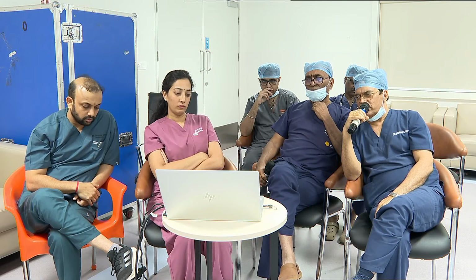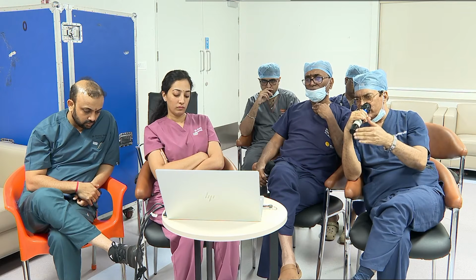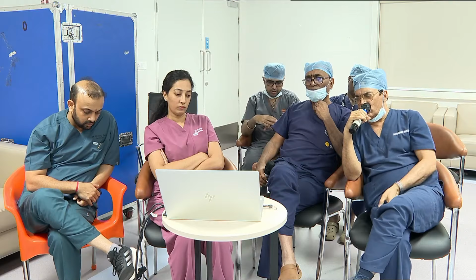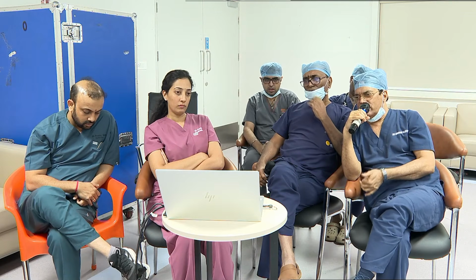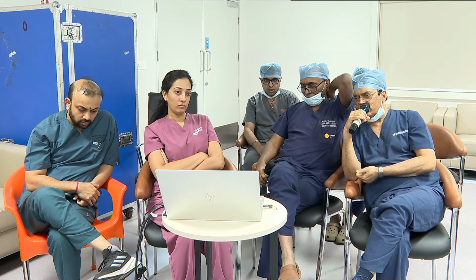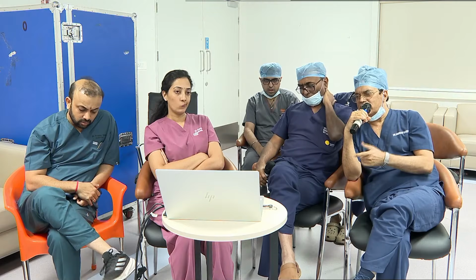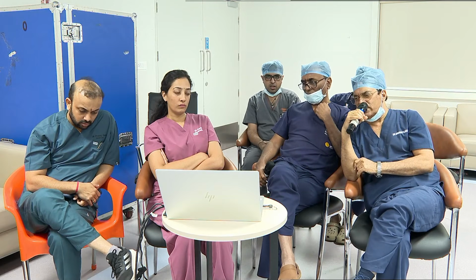So at that time also the patient may need a pacemaker. Suppose it is going to the LVOT, there is a chance of complete heart block. So assess the risk of complete heart block, assess the risk of the annular rupture, assess the risk of the paravalvular leak. These three are important points one should consider.